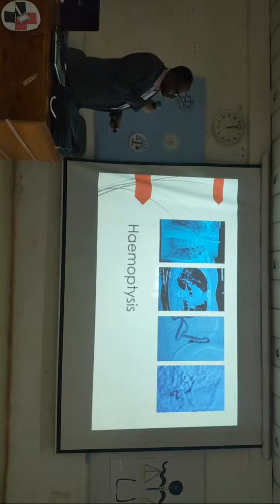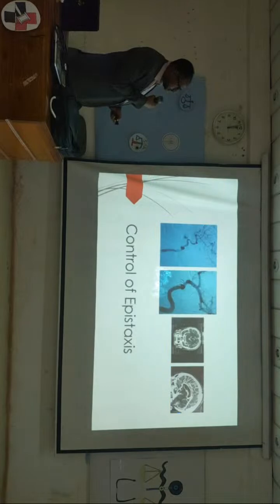And also we go here with a microcatheter. This is the bronchial artery, very dysplastic. This is the cause of bleeding, and we go with the microcatheter to reach the bleeding site, and we deliver liquid embolizing material here to occlude this site of bleeding, and then the hemoptysis stopped.